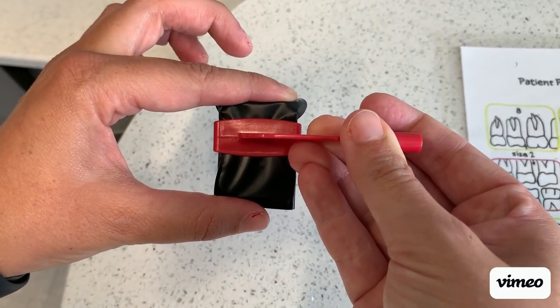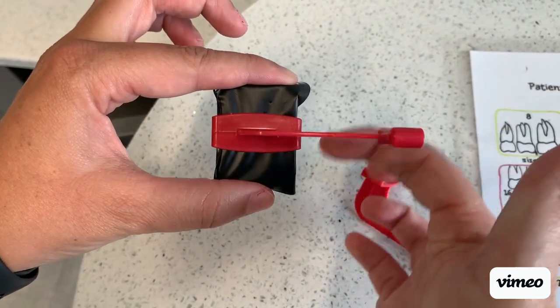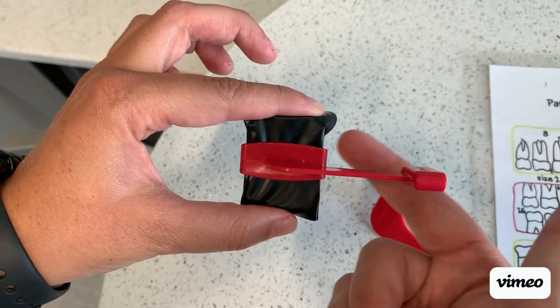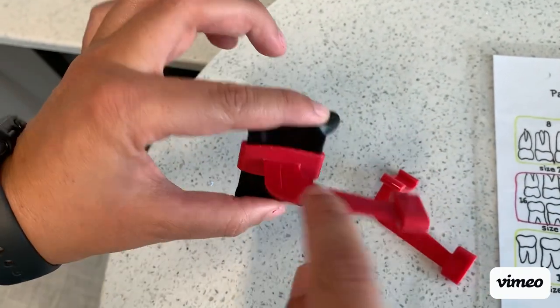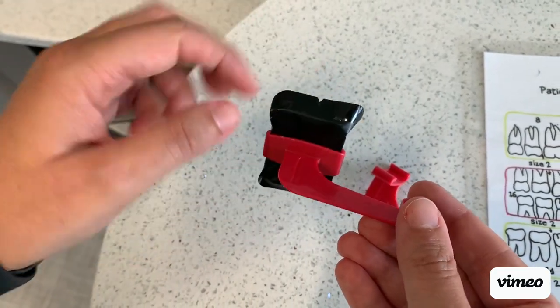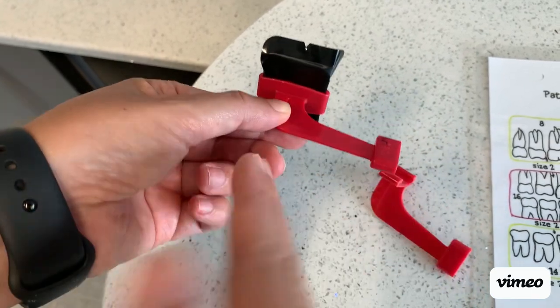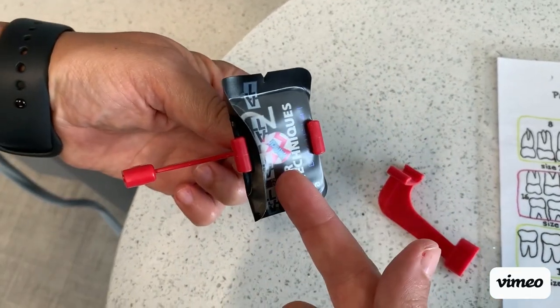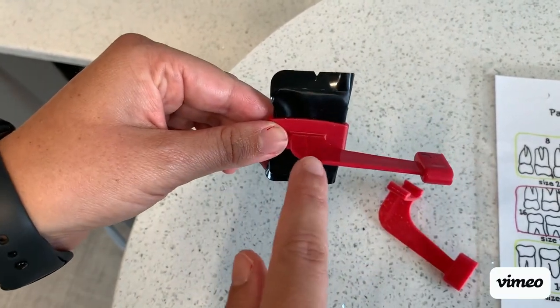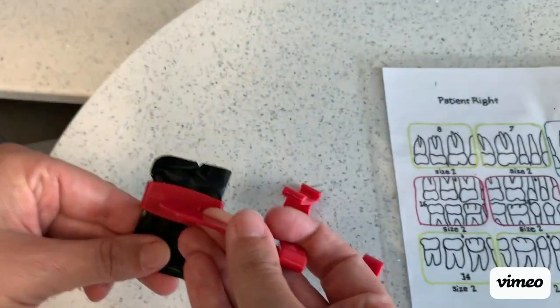You need to make sure the plate is centered up and down so that you're getting equal amounts of teeth on the top and bottom. The other thing to notice is that the black is facing the teeth. You always want the black to be what you're shooting towards, not the numbers. It seems counterintuitive to be shooting through the plastic, but you are shooting through the plastic.